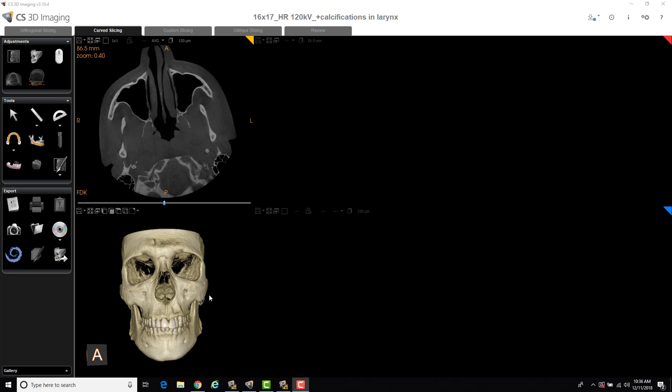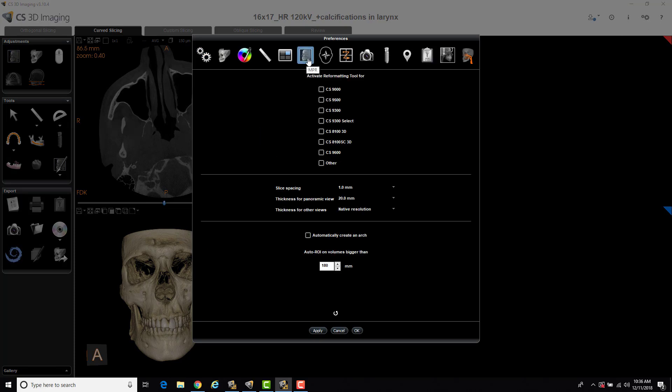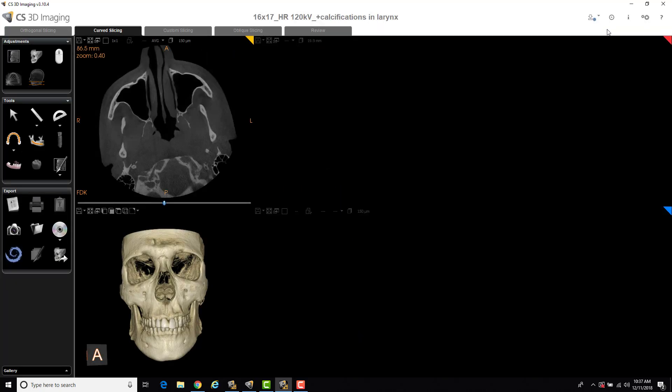So to do that, what you first have to do is go into the little edit preferences icon up at the top, and you're going to select the MPR icon right here, and here's your activate reformatting tool. So you'll see all the different CareStream products are listed. So if you're trying to reformat a 9600, of course you would check that one. If you're not sure which machine it comes off of, if it's a non-CareStream product, you can select other. And that's what we did in his case yesterday. In this particular case, we know it's a 9600, so I'm just going to select this checkbox, select OK.